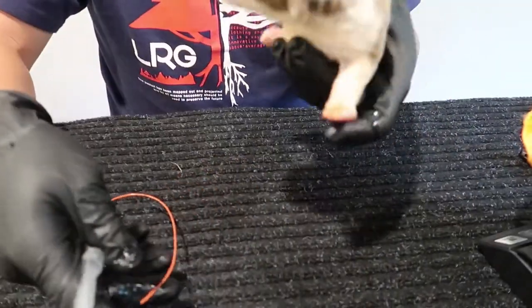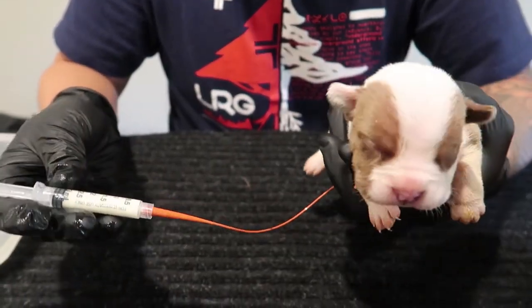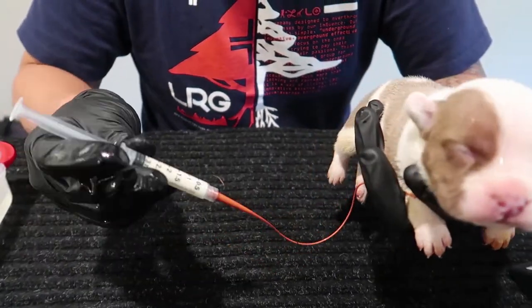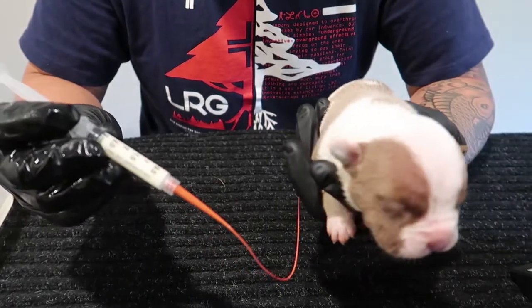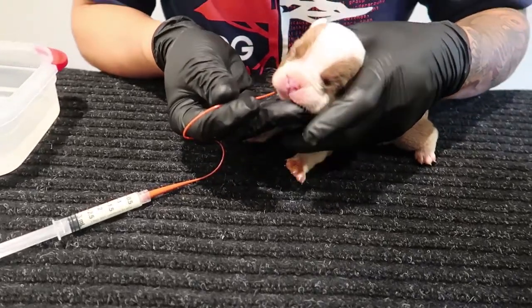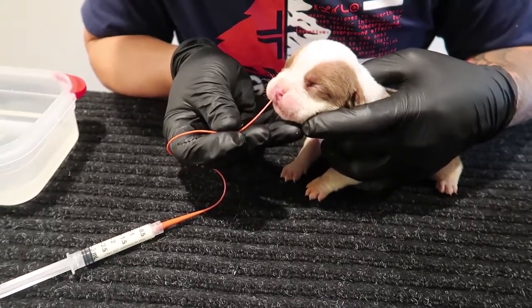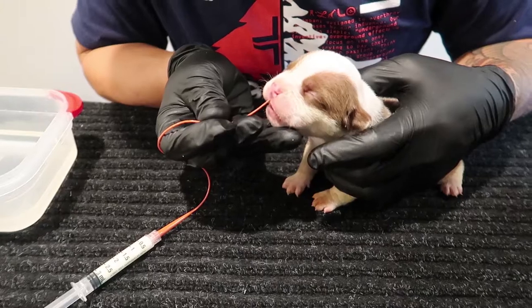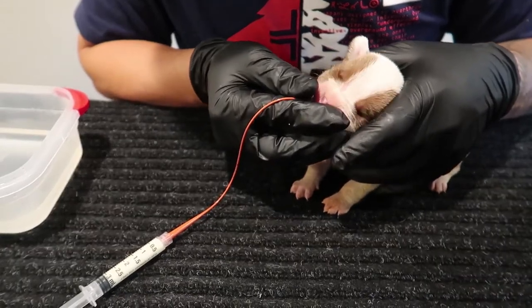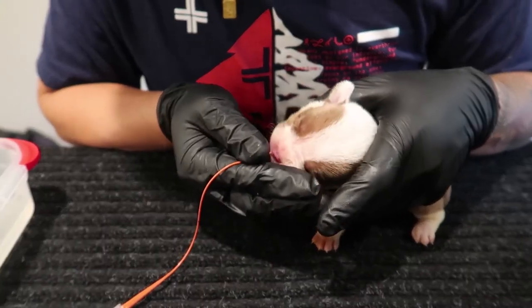Get the puppy. You want to do about 1cc for every ounce — she's about 16 ounces, but I'm just showing an example, so I'm going to feed her 3cc since she's been eating from her mom already. Put the catheter in the mouth and make sure she swallows it. Once she starts swallowing, it'll be going into the right tube, which is the esophagus. You don't want it to go into the trachea — that goes to her lungs and she could get pneumonia from it if you put it in the wrong tube.